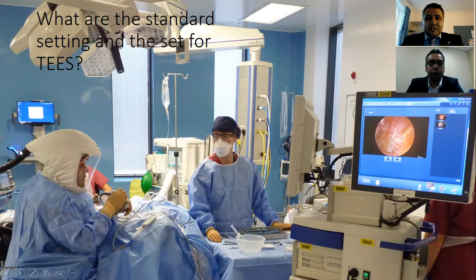This picture was taken during COVID — I was using a powered air purifier as I wasn't fitted with an FFP mask. As you can see, I sit down rather than standing, to preserve my legs for coming years. I sit in an armchair facing the screen in front of me, positioned at the foot of the patient's table. My assistant faces me. This is my preferred setup, but different surgeons have different setups.